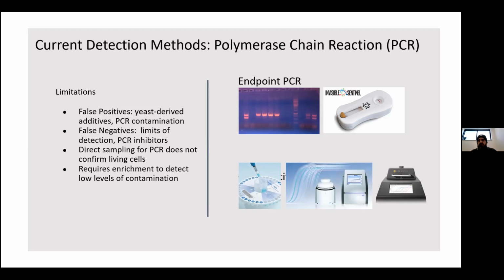The one they did multiple years ago was a wit, where they wanted some haziness, and then this current beer was in a hazy IPA style, and they were using an additive to help give them the stable haze. It turns out this additive is a yeast-derived product, and what they found when they tested that yeast-derived product itself is that it would light up their genetic tests for diastaticus. It wasn't really an issue, or they were never seeing overcarbonation here, because this is something that was added to the kettle, so it was boiled.